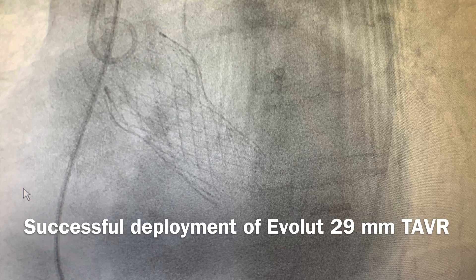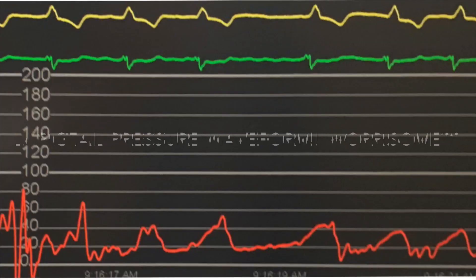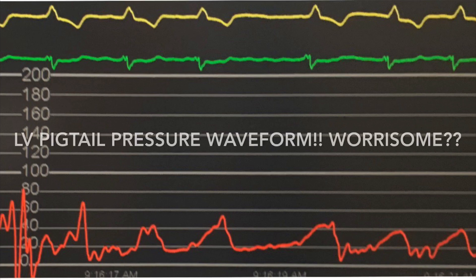Here we have a successfully deployed Evolute 29 millimeter TAVR valve and pressure is monitored through two pigtails. On hemodynamic monitoring we noticed that the LV pressure waveform is actually suddenly lower at 40 millimeters mercury, which was really worrisome.